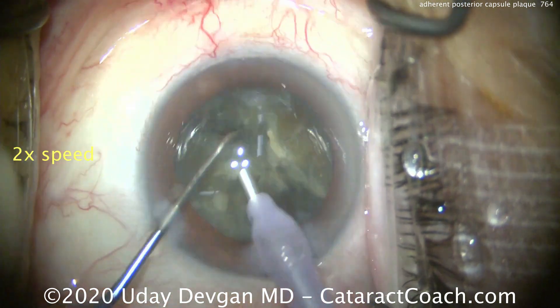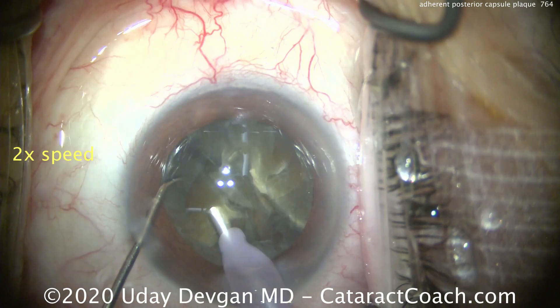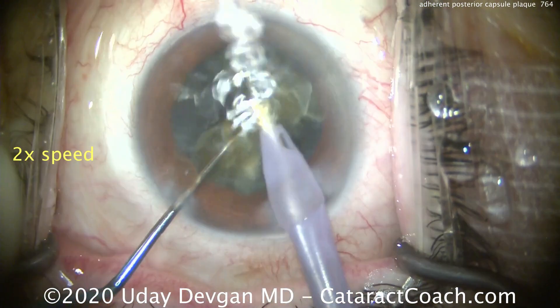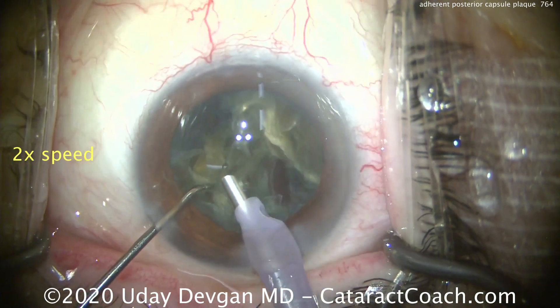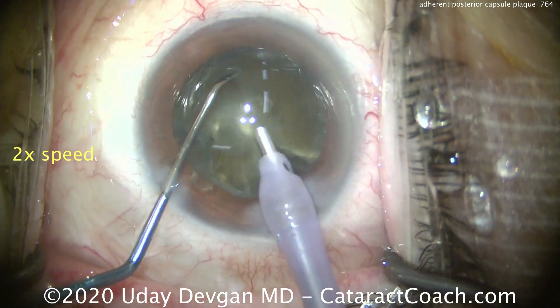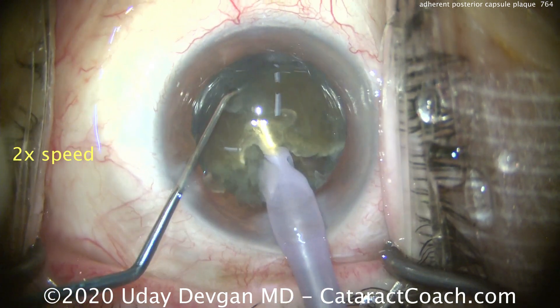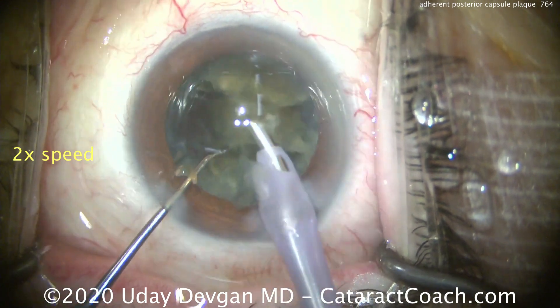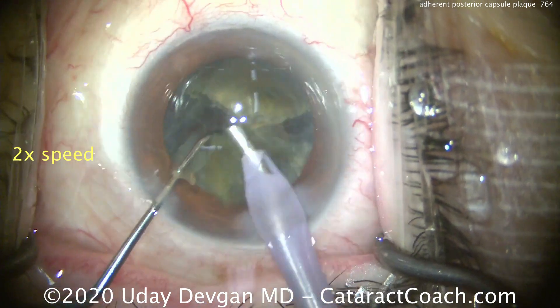We use our phaco chopper technique, buzzing with the probe, getting the chopper on the piece, and breaking them up, then emulsifying them down. Notice how we're floating within the incision with the instruments here. We're using phaco power modulations as well to help minimize the total amount of ultrasonic energy in the eye — chopping that dense nucleus into smaller and smaller pieces.